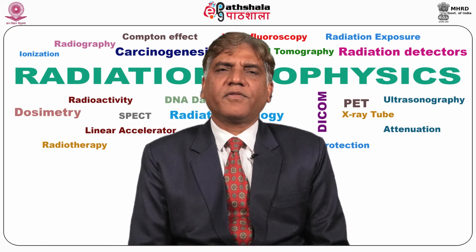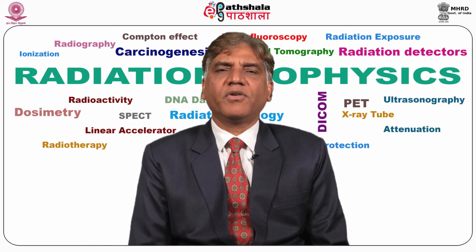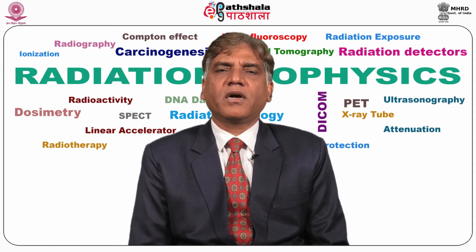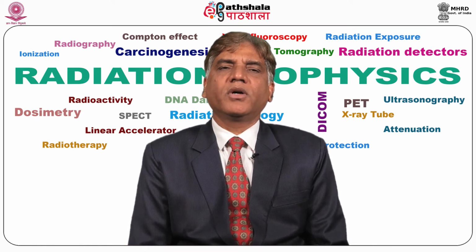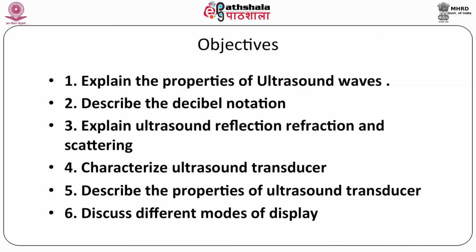The introduction of ultrasound is that sound having frequency more than 20 kilohertz is called ultrasound. Ultrasound imaging uses very high frequency, usually 1 megahertz to 7.5 megahertz sound waves, to create an image of organs and structures present inside the body in a real-time fashion.